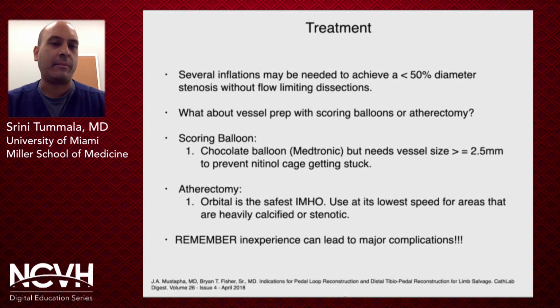Many CLI operators who are getting started ask me, well, what about vessel prep? Can I use scoring balloons? Can I use atherectomy? And if so, what type of atherectomy? Well, many doctors have used the Chocolate balloon by Medtronic. It's a relatively low-profile balloon. It causes really minimal trauma compared to other scoring balloons that are out there.